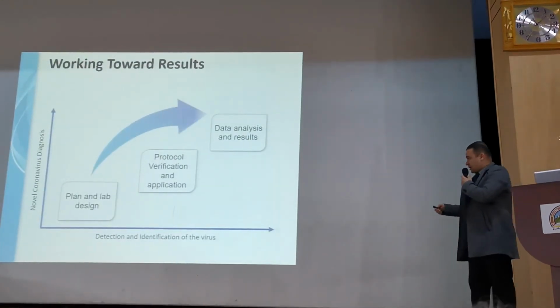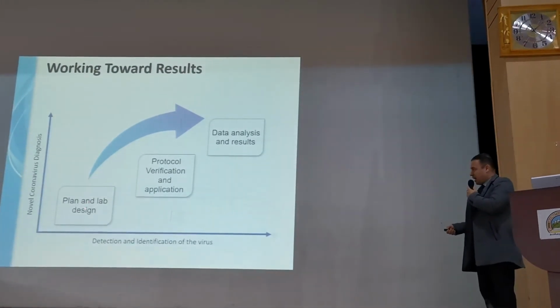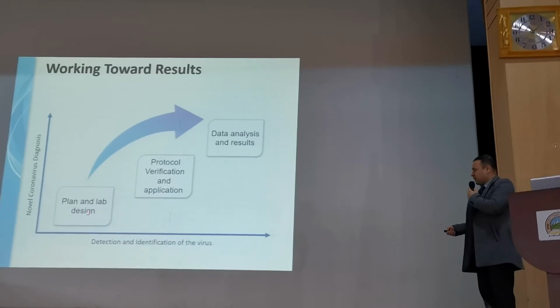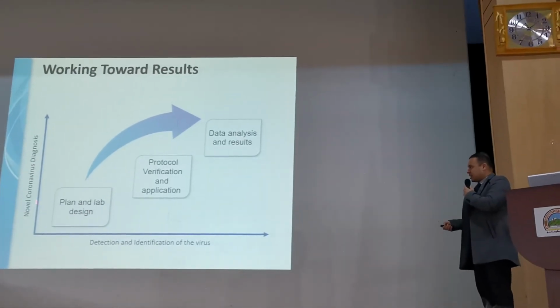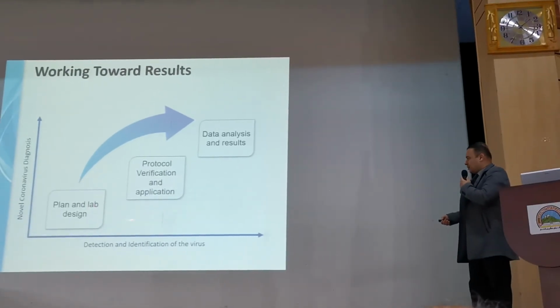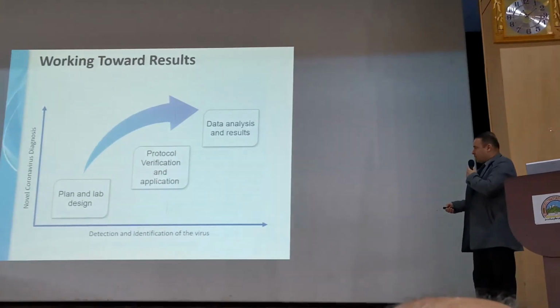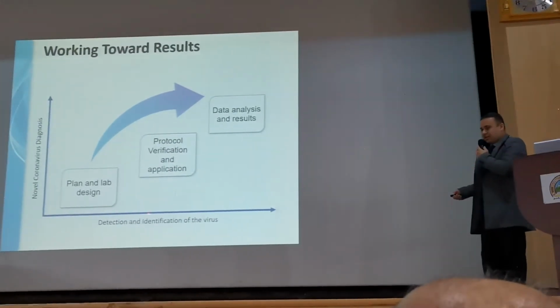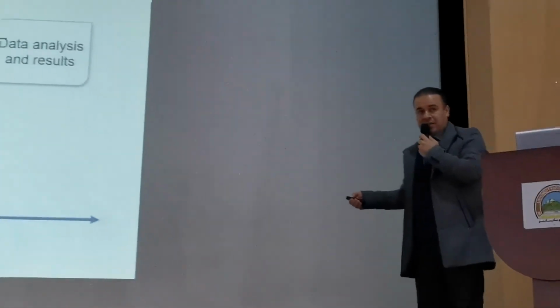So, as we said, we can plan for the lab as an emergency lab, as designed here, to detect and diagnose the novel coronavirus in our city, and also verify the protocol and work towards identification of the virus by further sequencing and data analysis.